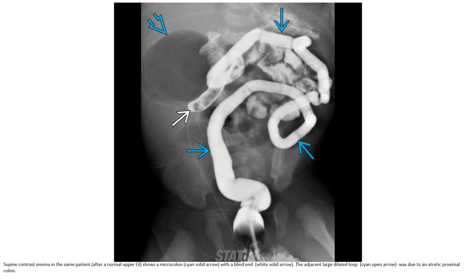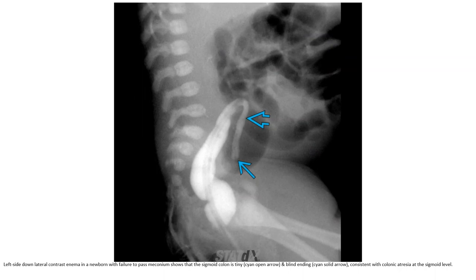Supine contrast enema in the same patient shows a microcolon with a blind end. The adjacent large dilated loop was found to be the atretic proximal colon. Left-side-down lateral contrast enema in a newborn with failure to pass meconium shows that the sigmoid colon is tiny and blind-ending, consistent with colonic atresia at the sigmoid level.